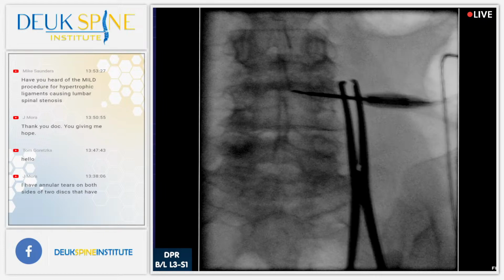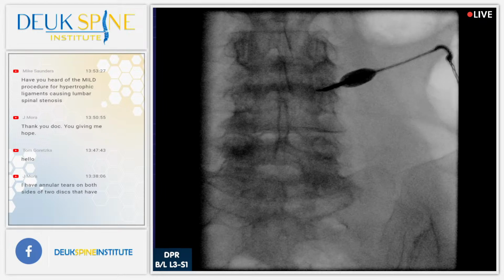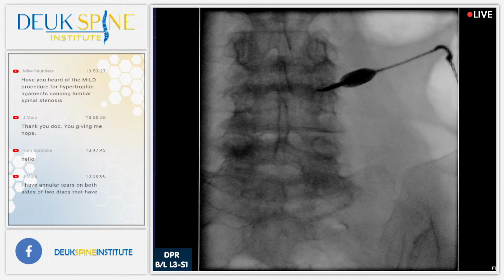I knew I was too medial. I should have known. It's tough when patients have some scoliosis because you end up having to compensate for that. Shot. All right, let's see our target. It's a little lateral to this.